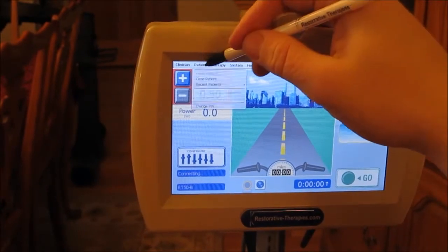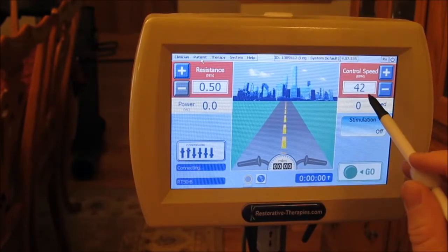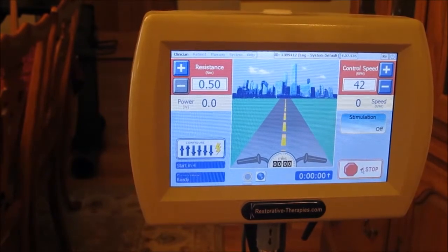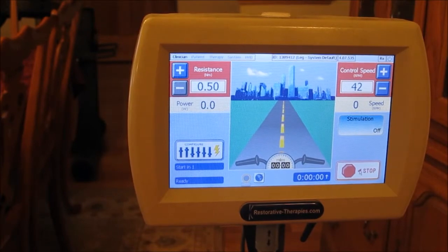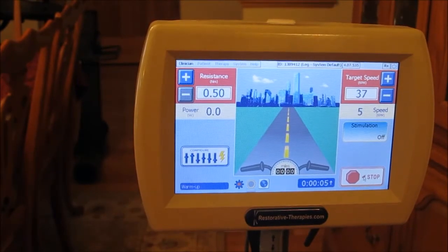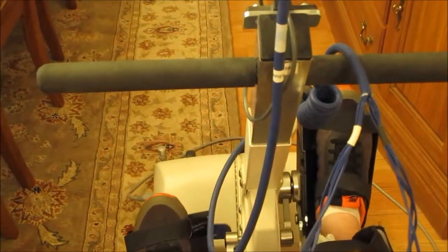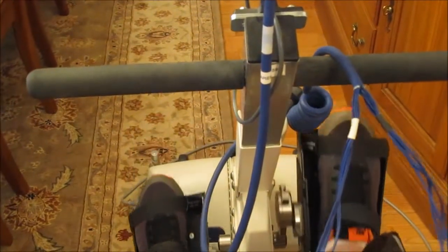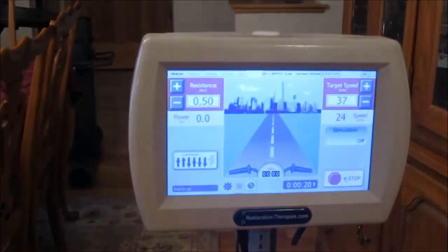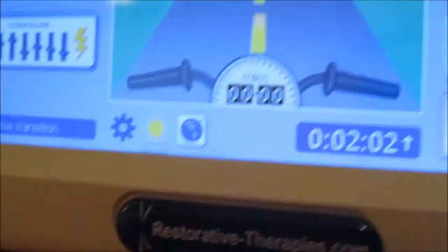I signed into my patient account, and my resistance is at 0.5 with my RPMs at 42, so now I just hit go. This beginning process is where the bike just has a warm-up, so there's no electrical stimulation shocks at first. All it's really doing is moving my legs in a nice rotation for the first minute, and then as the first minute approaches, the stimulation will go up, and everything is monitored on this screen.